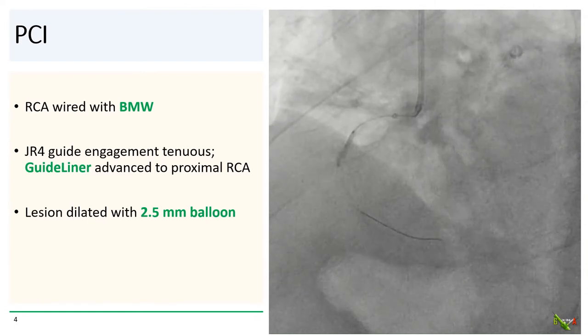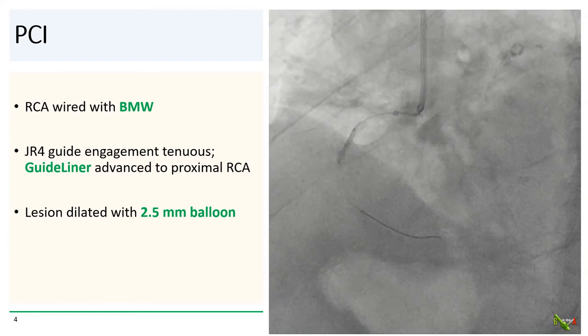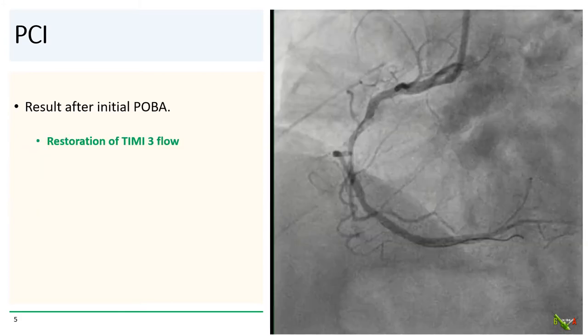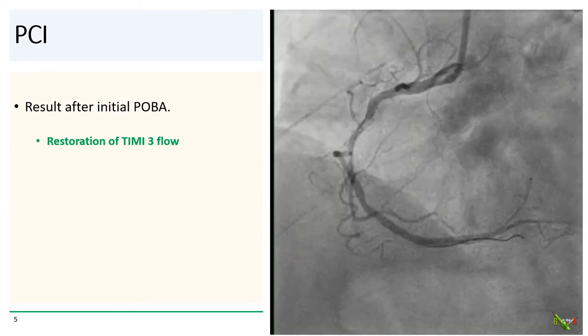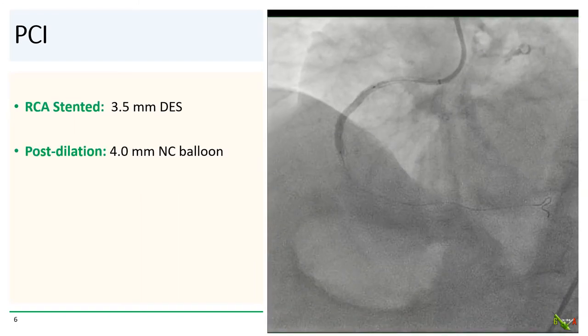Guide engagement with the JR4 was quite tenuous, so a guide liner was needed. The RCA was wired with a BMW and dilated with a 2.5 mm balloon. After angioplasty, we got flow back in the RCA. The RCA was then stented with a 3.5 mm DES and post-dilated with a 4.0 mm NC balloon.